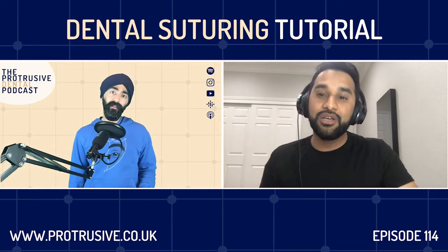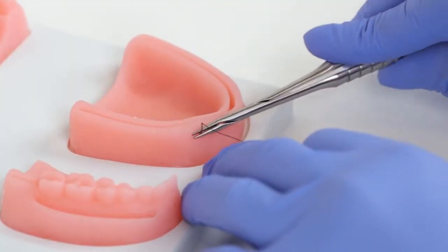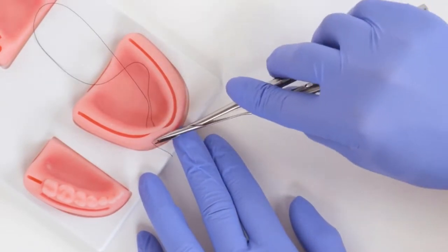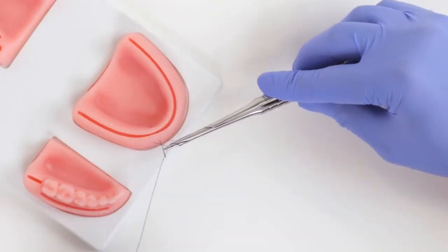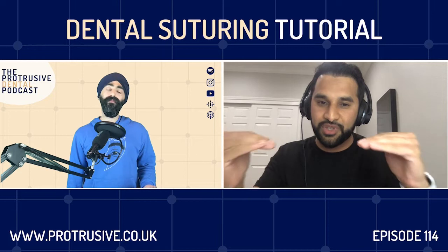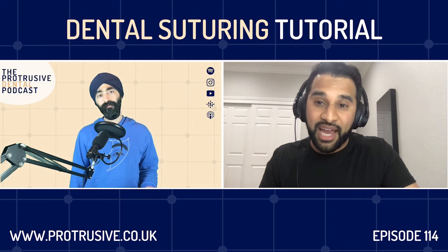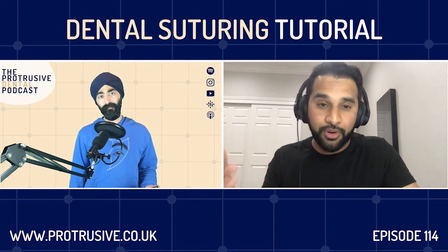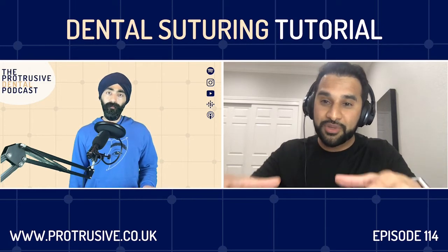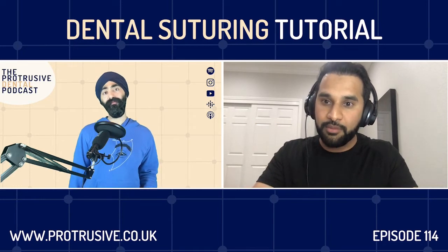Exactly. When you think about it, the horizontal mattress has two entry points, basically mesial and distal. When you close, and say you're trying to bring together the tissues with a little tension, if you pull too tight on the knot, you choke the tissue, because the knot is horizontal across. The horizontal mattress can actually be used, as a clinical example, if you're biopsying something: you can place a horizontal mattress at the base of it and cut your lesion out, and it holds hemostasis. Clever.